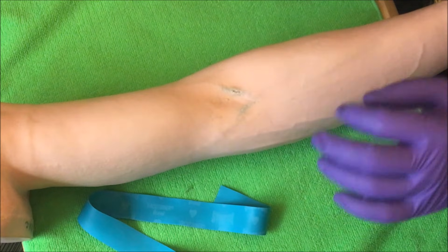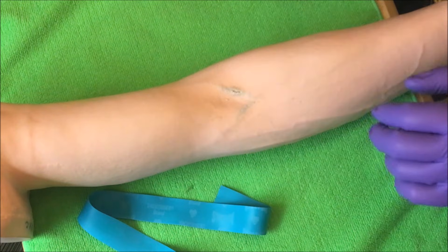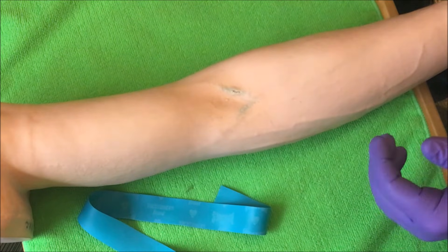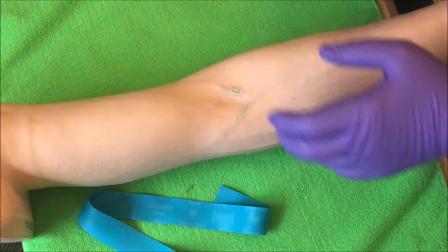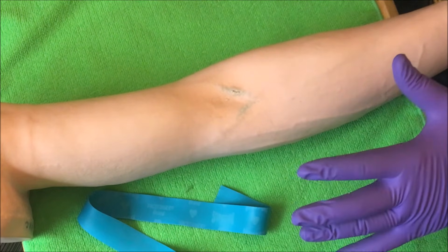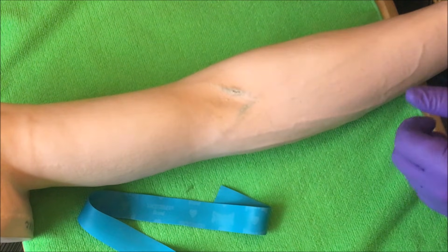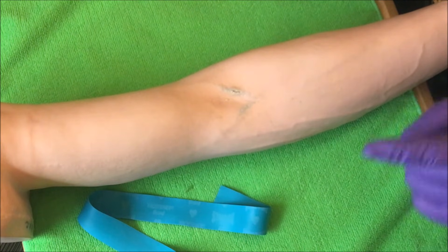Now, first thing to understand: I always wear gloves. When we're dealing with patients, I don't like to make skin-to-skin contact because we don't know what the patient could have or what could be transmitted to you. I don't want to carry anything back home to my family. A lot of phlebotomists like to have no gloves on and handle the patient's arm, but the patient is in the hospital having blood tests — I'm not about to take chances. So I always wear a glove before making contact with the patient, though it is ultimately an option.